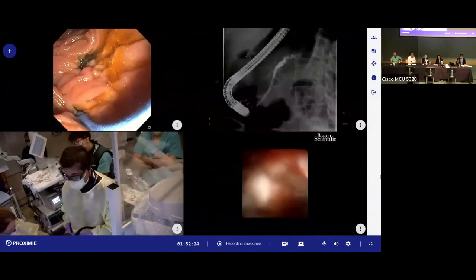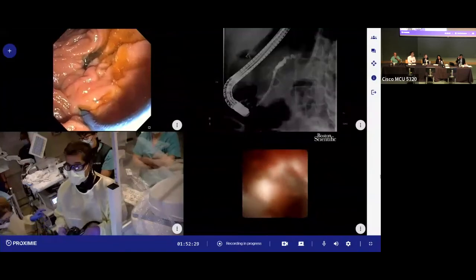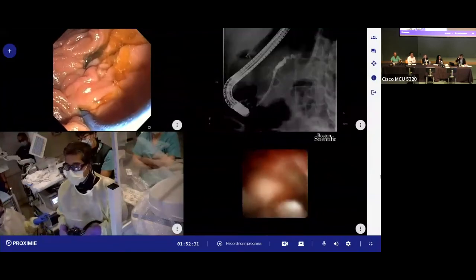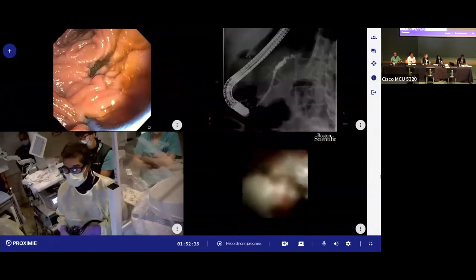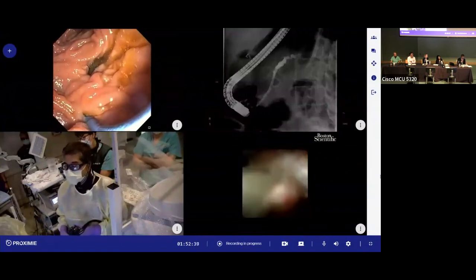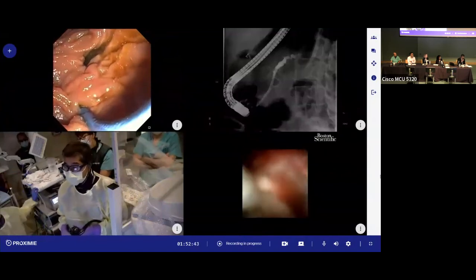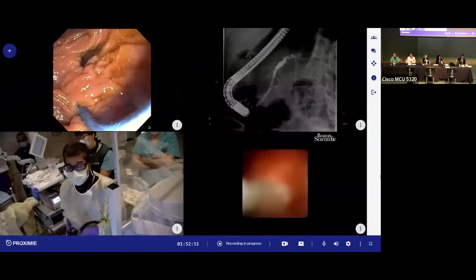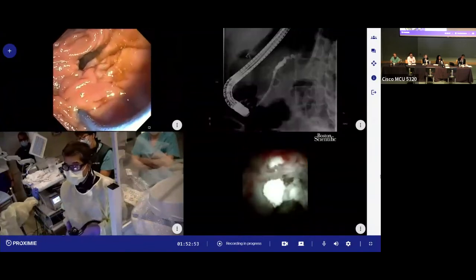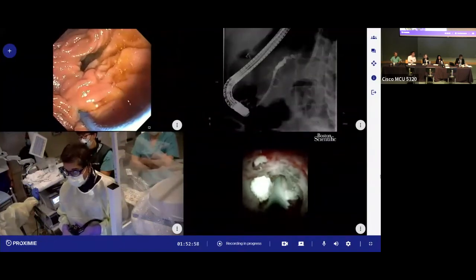Yes, thank you. Okay, so we're just going to get the wire up. Someone may ask about balloons to try to remove these fragments. I think that's a bit futile right now. It's high up in the duct. I think what we do is, there's swelling, edema. We get a stent in and bring the patient back. We use a basket, probably. I would use a lithotripter basket, like a 1.5 centimeter, to drag it, just in case you get the basket stuck. Irrigate here. I don't think we would need to do SPY again, but here we go.